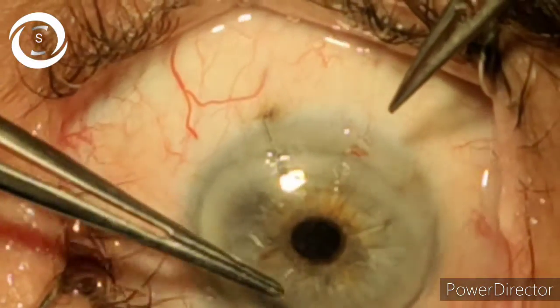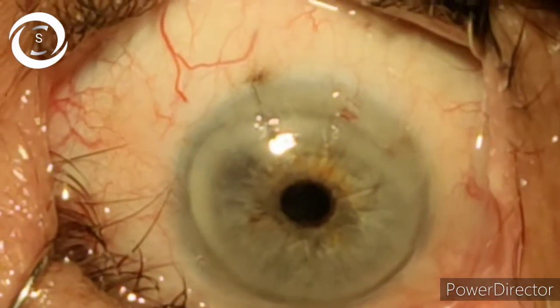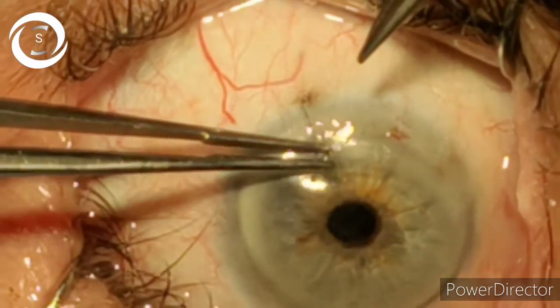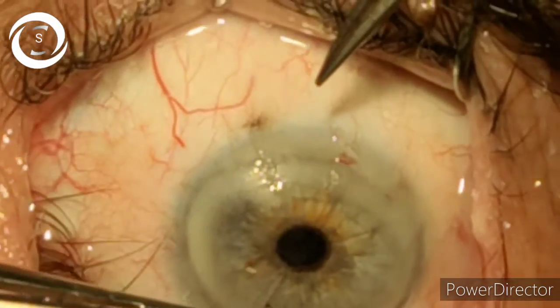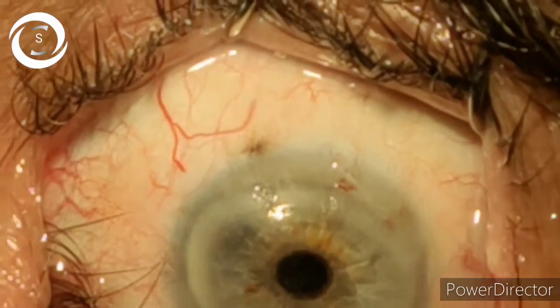Then remove the third one under aseptic conditions with povidone-iodine, taking all the precautions of cataract surgery. Thank you very much.